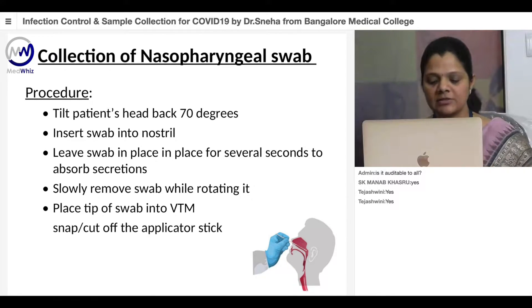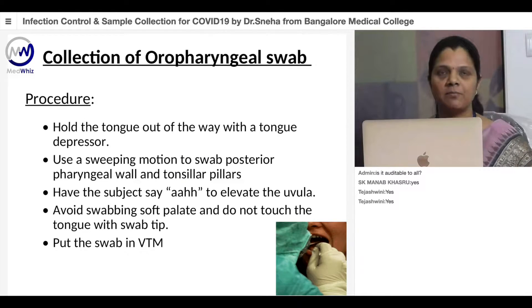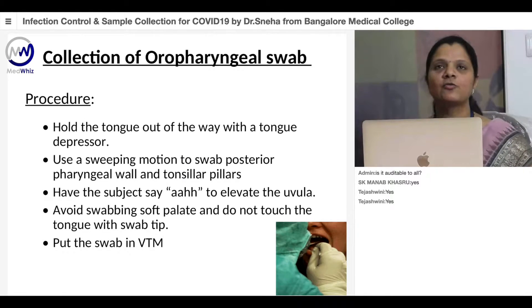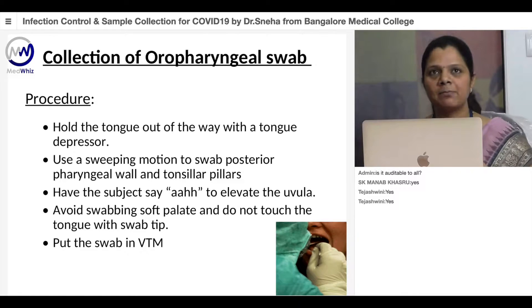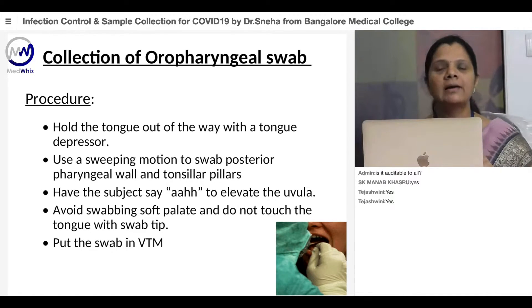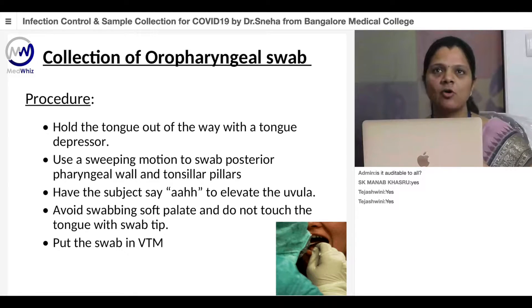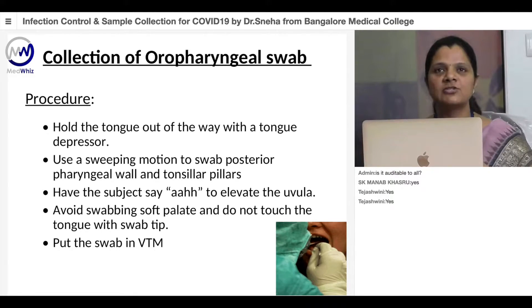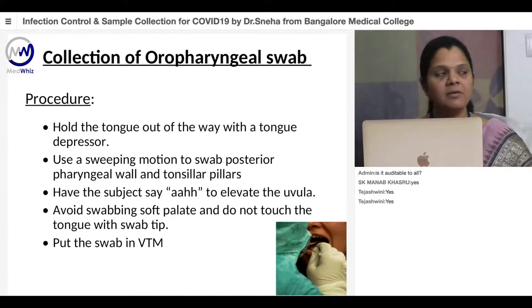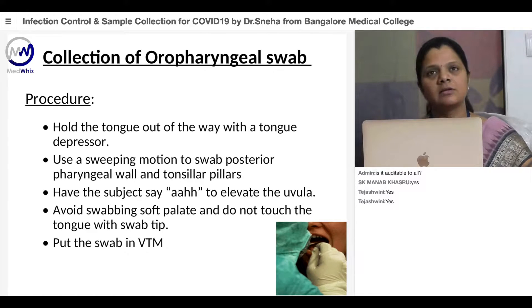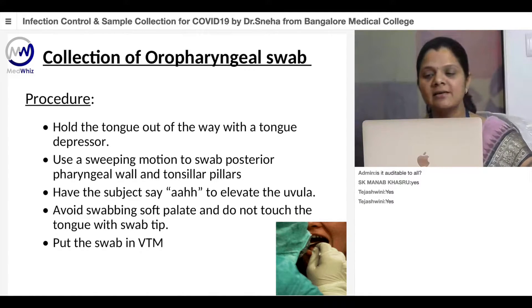Next, collect the oropharyngeal swab from the same patient. Ask the patient to hold the tongue out, use a tongue depressor, and ask the patient to loudly say 'ah'—this elevates the uvula and helps with sample collection. Insert the swab and collect the sample from the posterior pharyngeal wall or the tonsillar pillars, avoiding the soft palate or tongue. Take out the swab and place it into the same viral transport medium that contains the nasopharyngeal swab, so both swabs go into a single VTM.